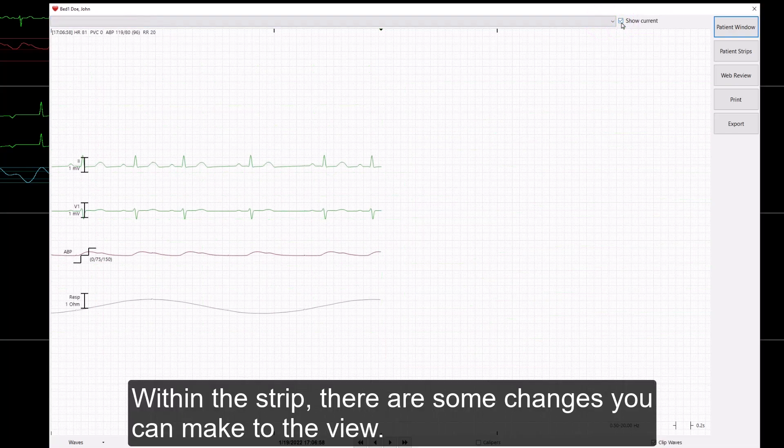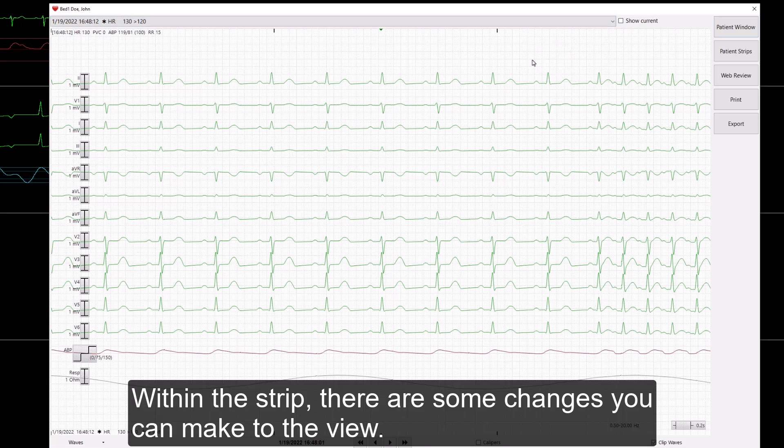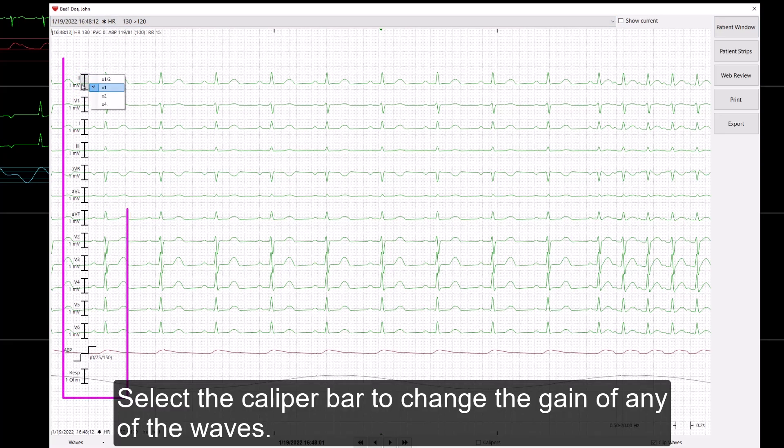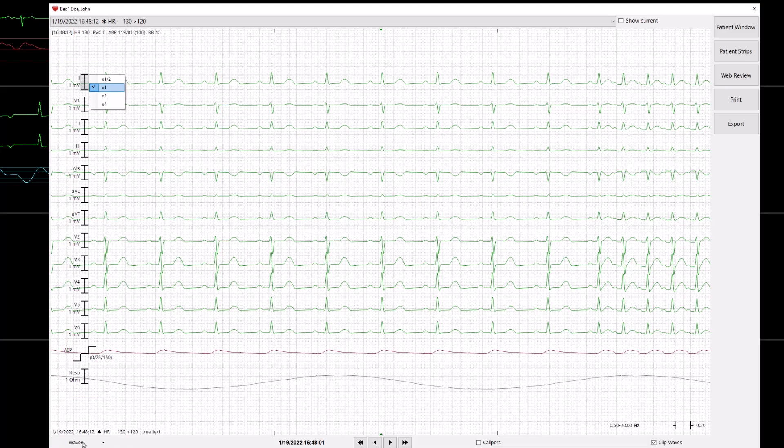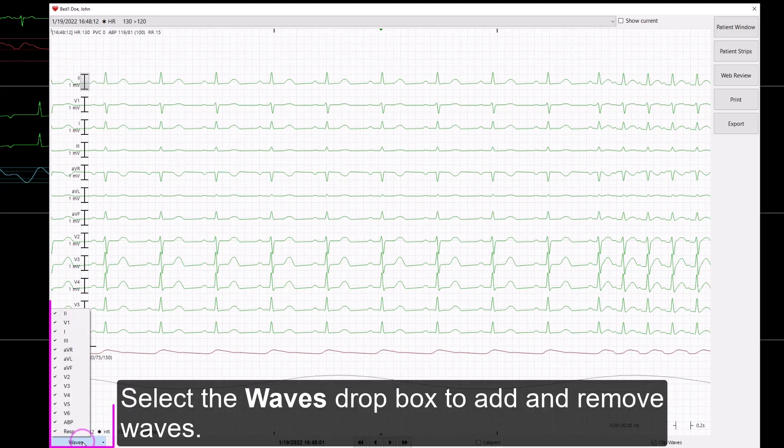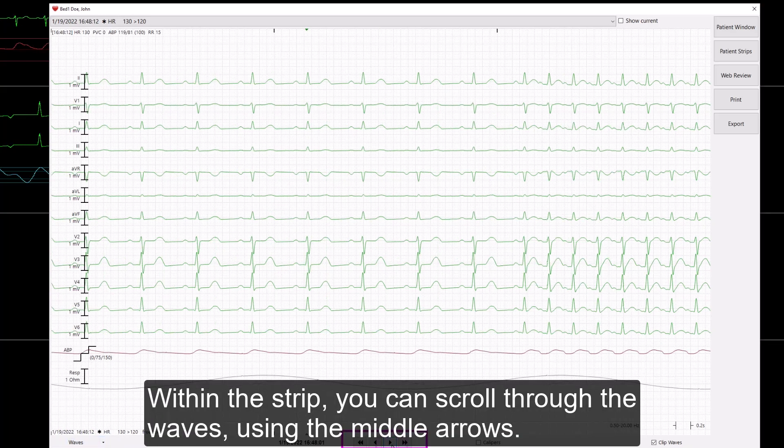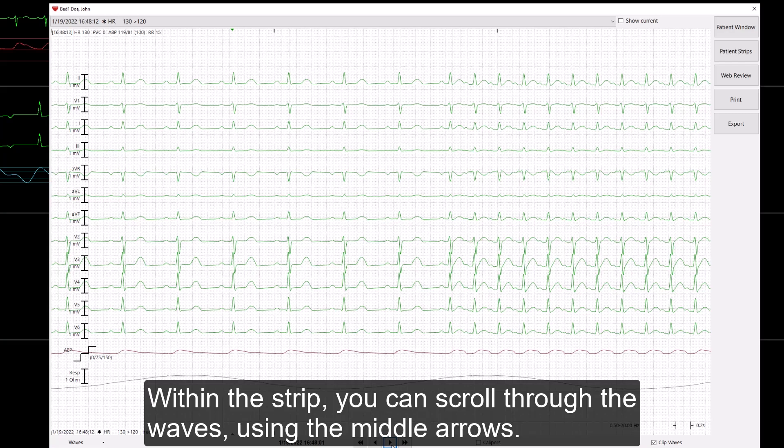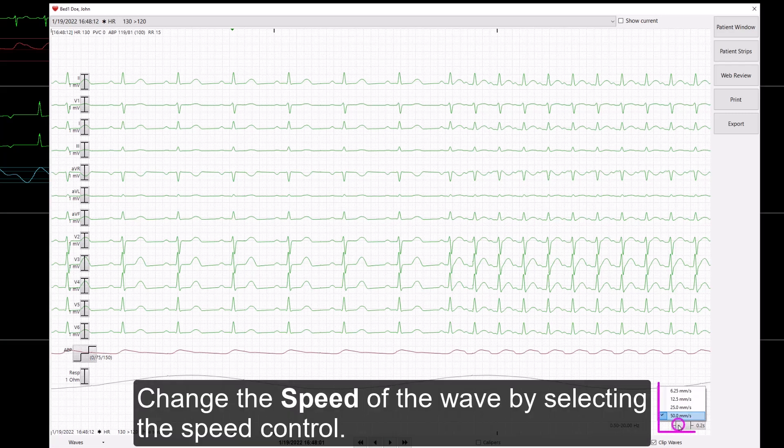Within the strip, there are some changes you can make to the view. Select the caliper bar to change the gain of any of the waves. Select the Waves drop-box to add and remove waves. Within the strip, you can scroll through the waves using the middle arrows. Change the speed of the wave by selecting the Speed Control.